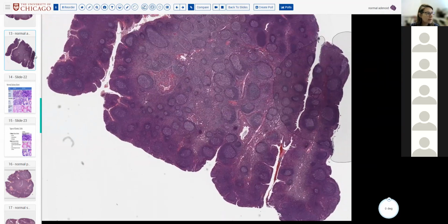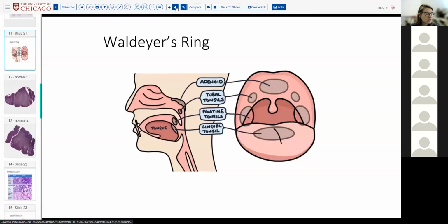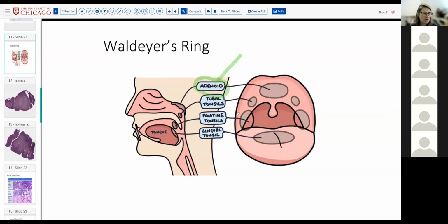The two things I will mention about the tonsils and the adenoids, since we're here, we'll get a little glimpse into the pathology. Those of you who have seen these cases on the head and neck service before will know that there are specific types of viral-related cancers that occur in the adenoids and viral-related cancers that occur in the palatine tonsils. Does anybody want to name what they are and what the viruses are?